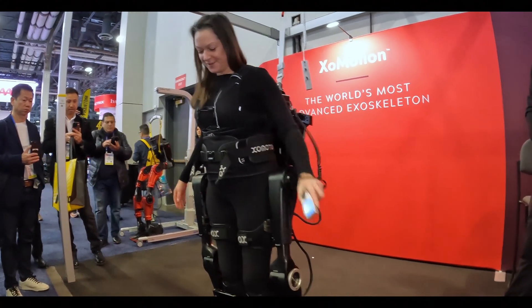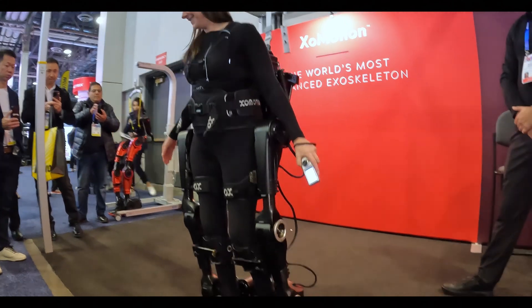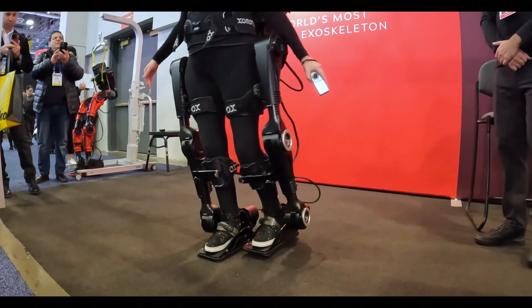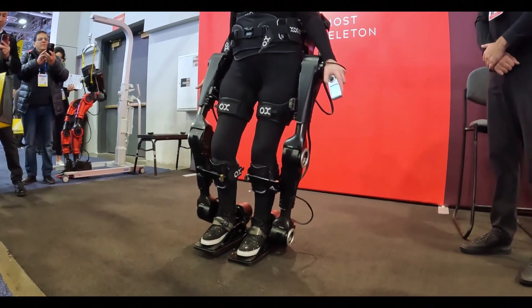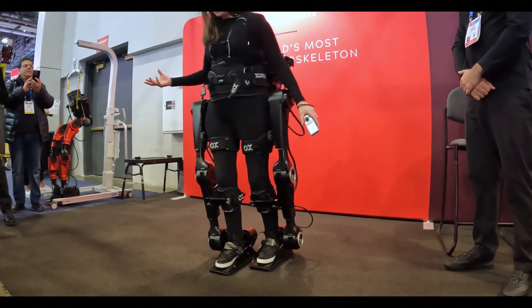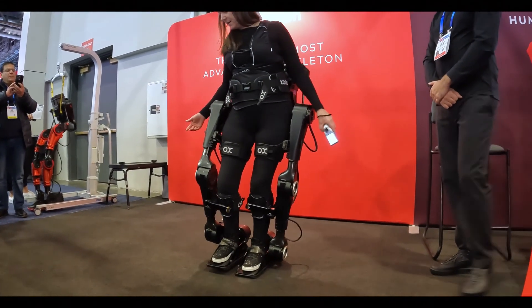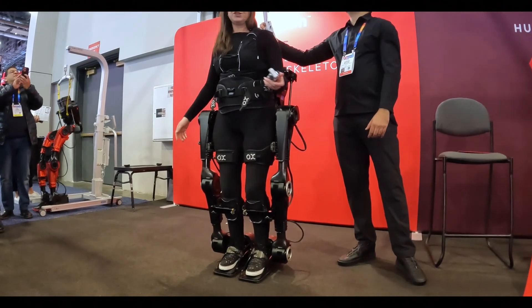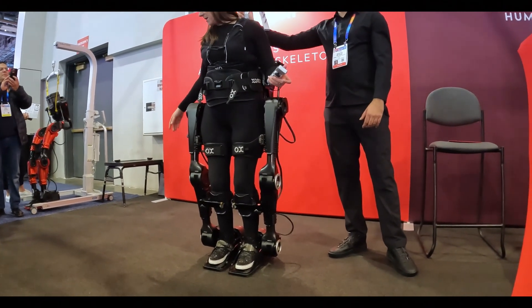What goes forward must also at times go back. A really important part of human movement is going in all directions, and that's what is so advanced about our exoskeleton — the ability to move in all directions. You can see I can do a sideways walking motion as well.